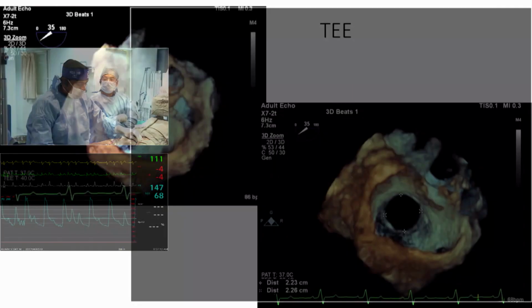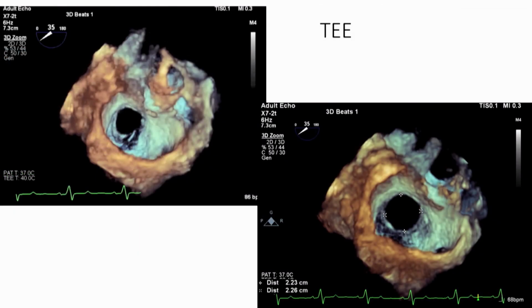Today we are planning it by intracardiac. Show the transesophageal echocardiogram. Please show the transesophageal echocardiogram once again. Keep showing the coronary angiogram. Yes, sir. Explain the coronary angiogram. Show me the coronary angiogram. So this is RAO caudal view, coronary angiogram. No, first show the echo.